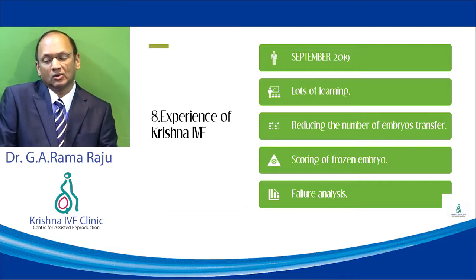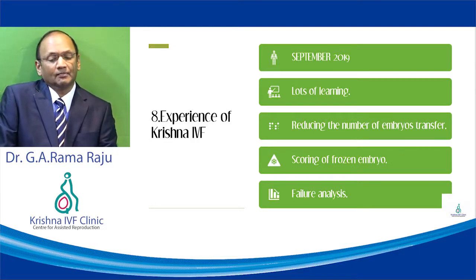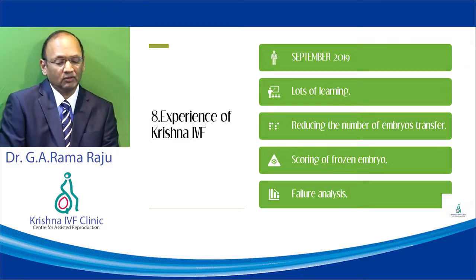Last but not the least, when a cycle fails, we are able to go back to the film and look at where things failed. So, the failure analysis part is also helping us. If the embryo is perfectly fine, then I might look at immunological causes or uterine causes as a cause for failure.